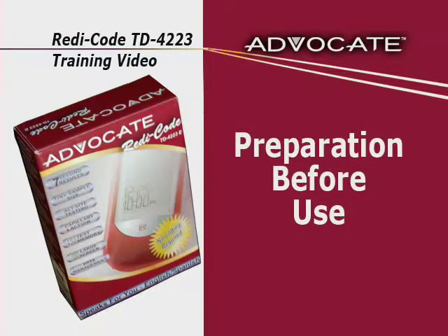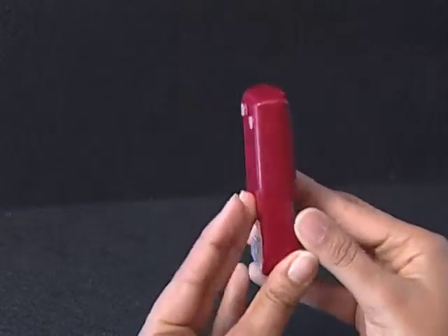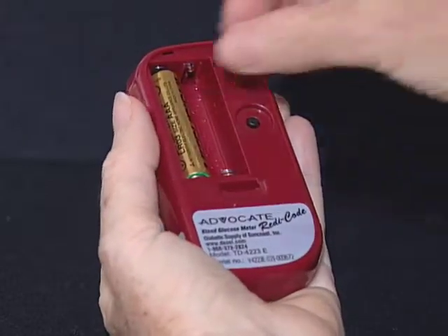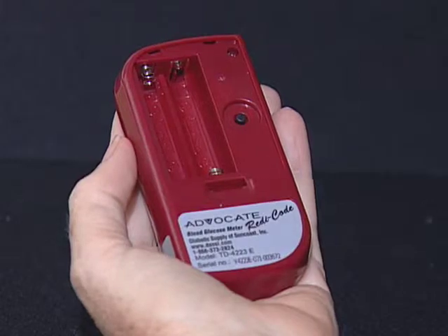Your meter comes with two 1.5 AAA size alkaline batteries. To install the batteries, make sure that the meter is turned off. Press the edge of the battery cover and lift it up to remove. Remove the old batteries and replace with two 1.5 AAA size alkaline batteries.